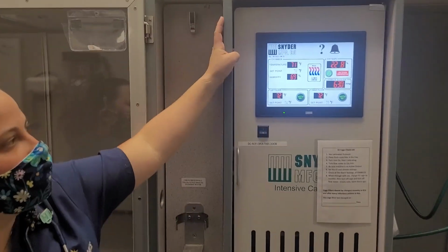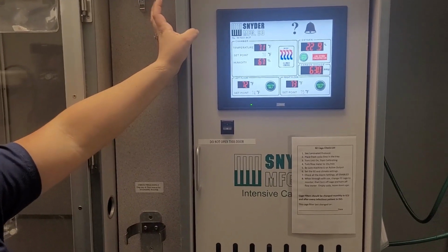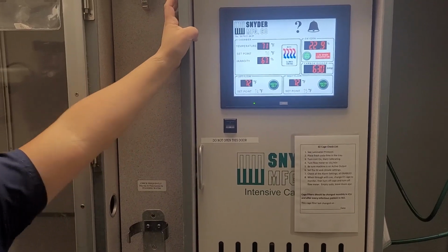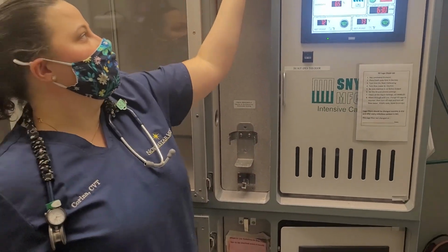The other problem is the humidity. So your chamber humidity is usually due to water buildup, condensation from your animal breathing. Basically, you don't want to keep your cage on dehumidify because then it freezes up your condenser. If your humidity is climbing, what you want to do is open up your B door.